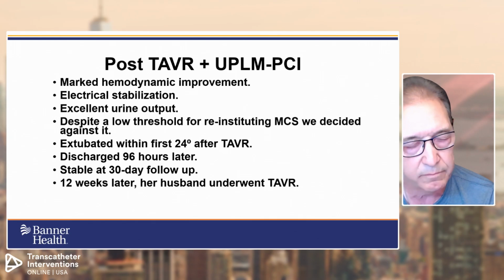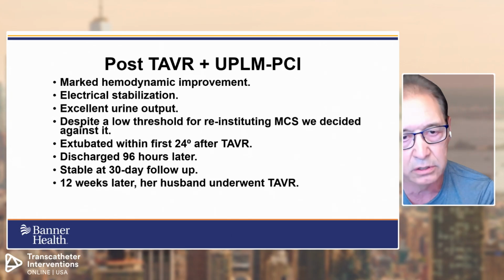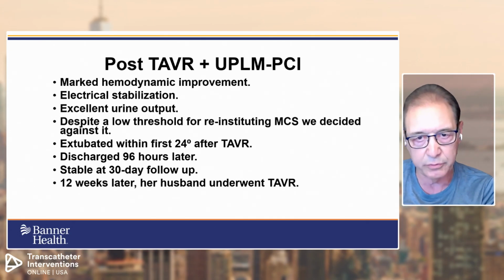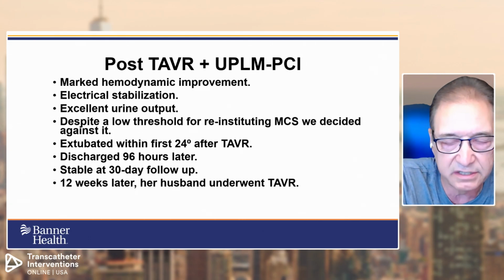I think the benefit of IVL in this case was that we didn't have to use rotational atherectomy because we had obvious concerns about that. And I only showed the TAVR because it was part of the overall strategy in the case.